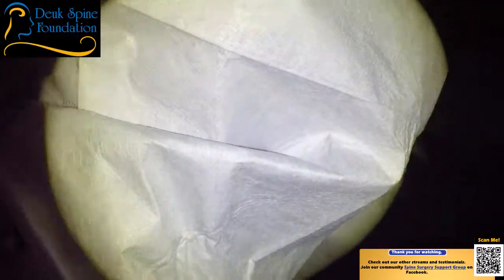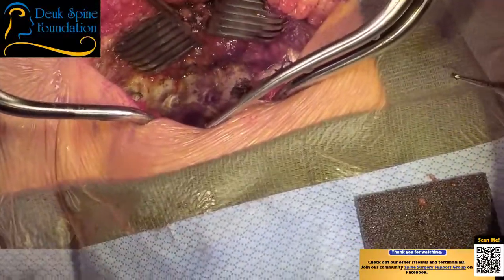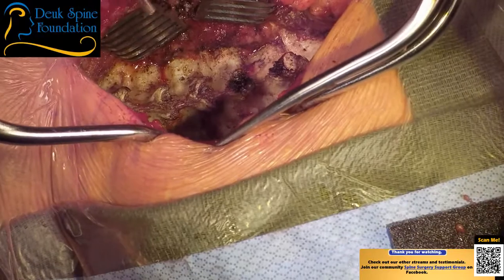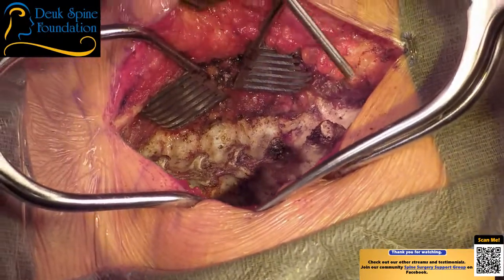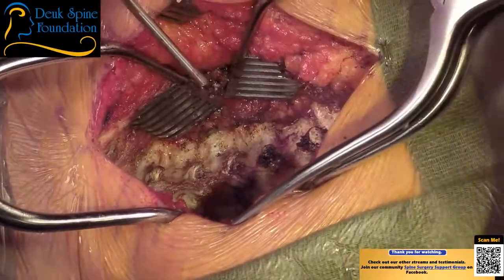There's really, let's see, 2, 3, 4, 5, 6, 7. 6, 7 is the last bad area. So we only need to remove 7, and we should be decompressed. Once we do our laminectomy, we're going to take the lamina and spinous process out. Luis is going to clean the soft tissues off of it, and that's beautiful autograft. We've got lots of stem cells and nice trabecular bone to promote fusion. So it's got basically everything you need to make the spine fuse in that bone we're about to get out.